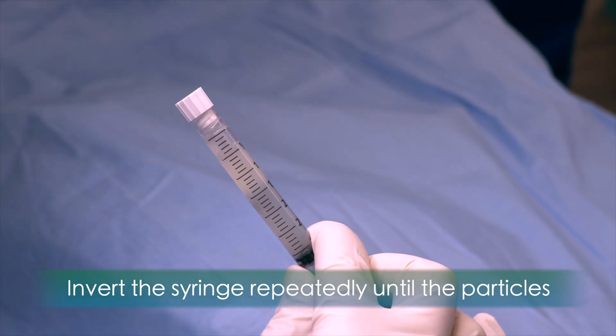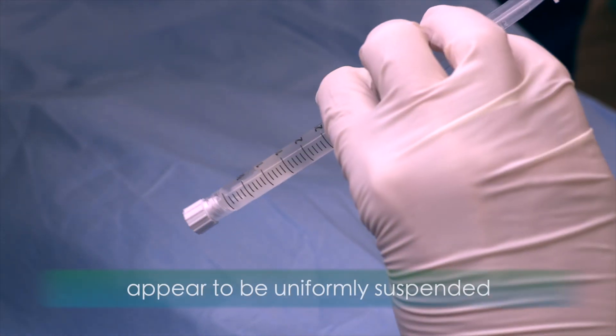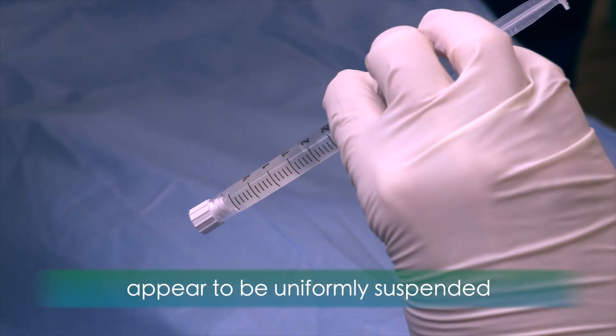Before you perform your injection, invert the syringe repeatedly until the particles appear to be uniformly suspended.